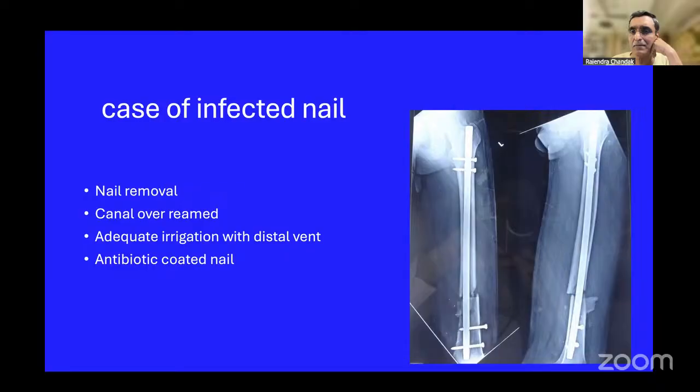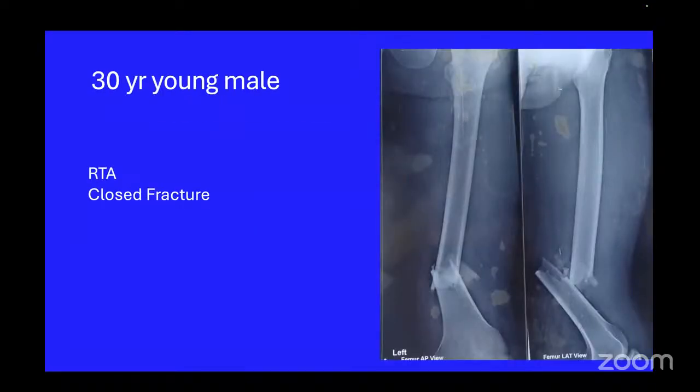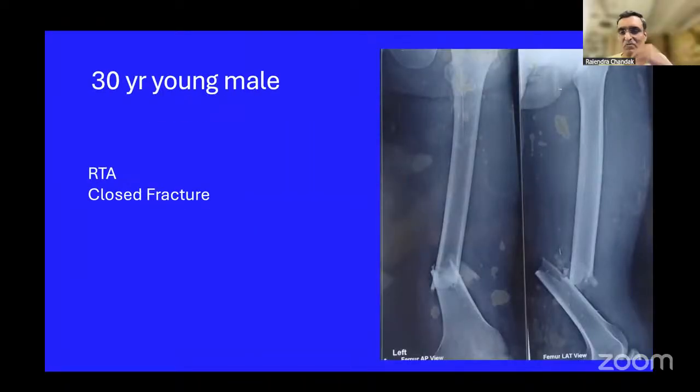So we have to keep an antibiotic cement spacer at the fracture site. Yes, we have to keep antibiotic cement spacer both intramedullary, which would be with the nail, and at the fracture site also. If you use an antibiotic spacer, that is good.